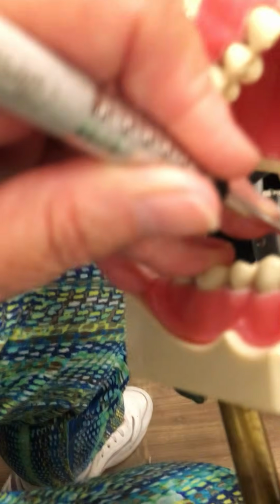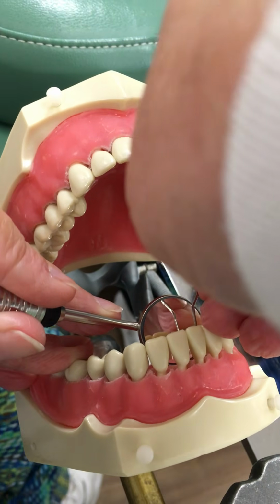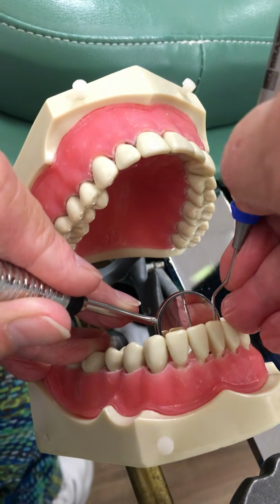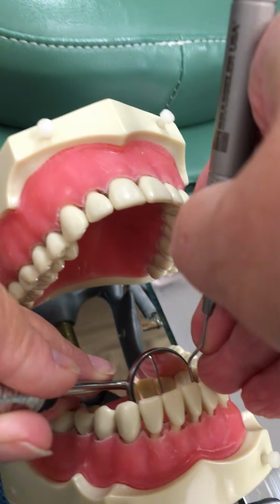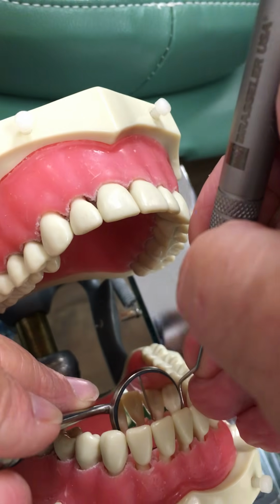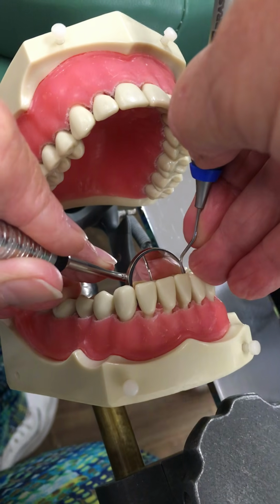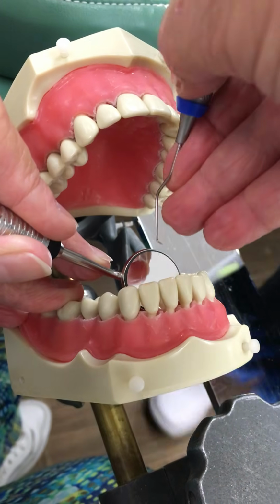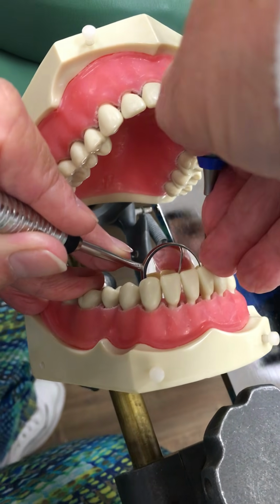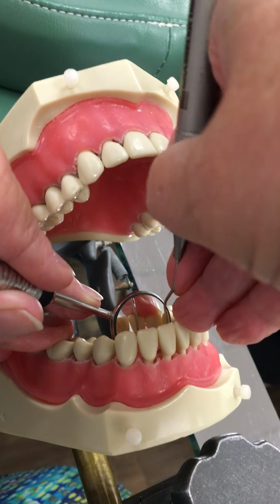And start at the middle because we're going in the toward direction. My toe is facing toward me and I am facing toward the patient. Toward, toward, toward. And as I come around the corner, do you see my shank? It's straight up and down with the long axis of the tooth. Do you see that? So you imagine if we drew a line down the midline, my shank is parallel. Do you see that? And we'll pick my fulcrum up and I'm going to move to the next tooth.